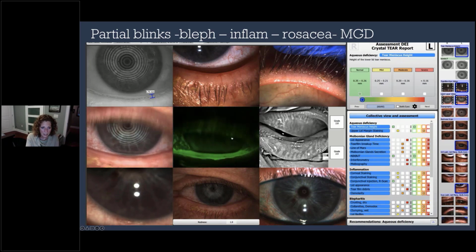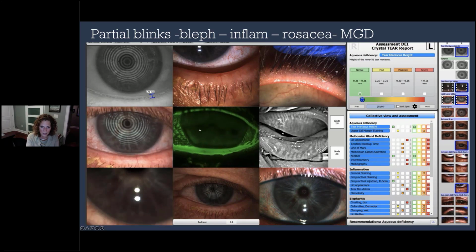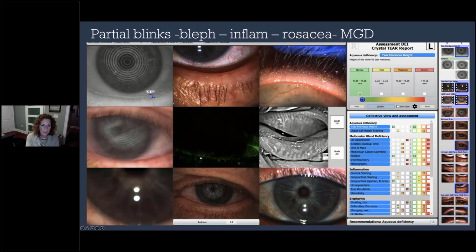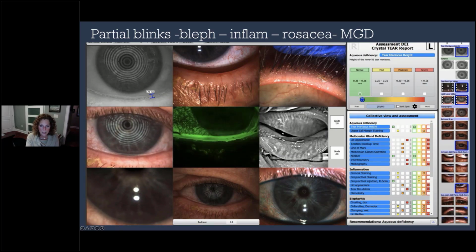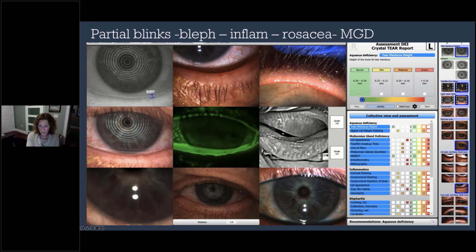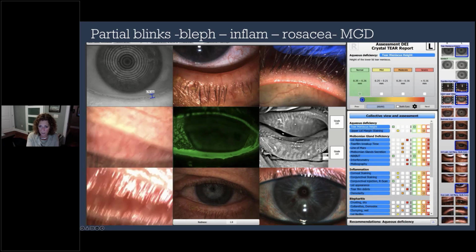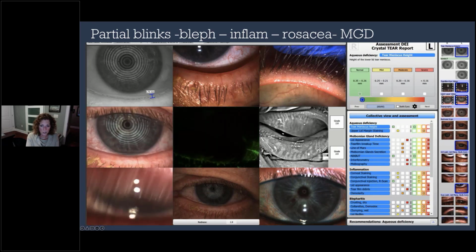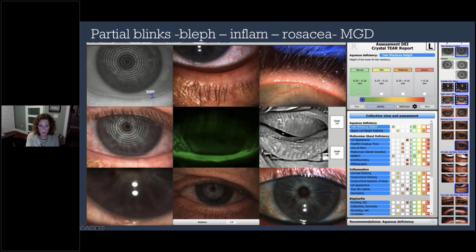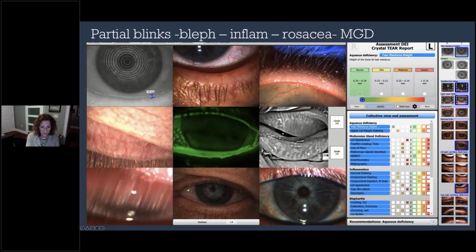Now look at this. I can also see that over and over again, you're not coming down with your blink. See how this line is formed across the middle, and finally you blinked. This is a problem because then you're not milking these oil glands, and eventually they end up clogging up and basically dying. The body dries them up because the oil's not being milked. I'll show you what normal looks like and how you compare, but we really got to get this oil moving. There's some debris in the tear film, not too bad, but we just have a lot of inflammation.